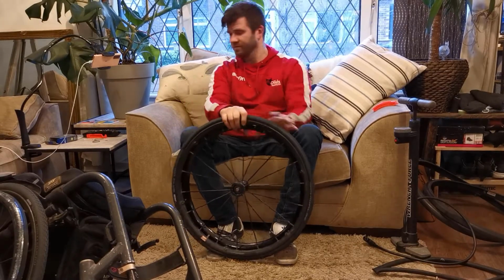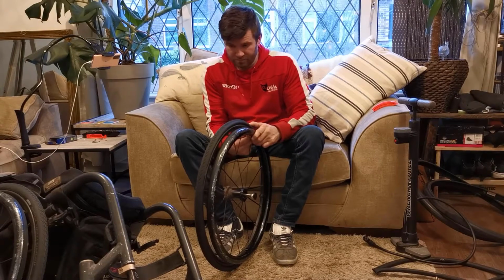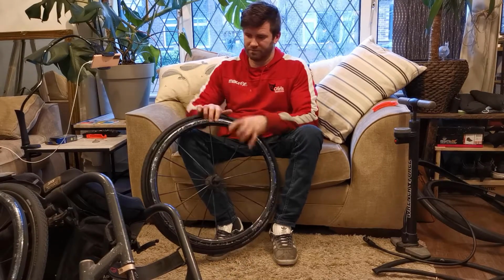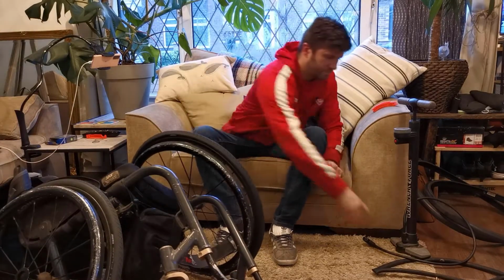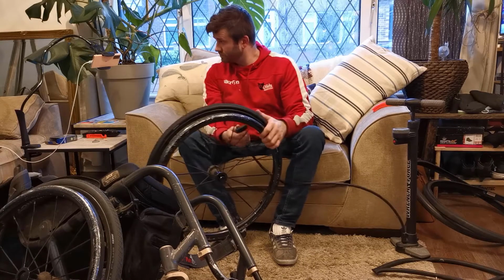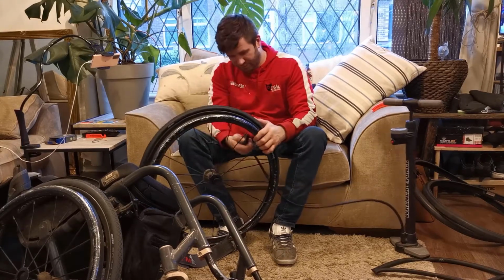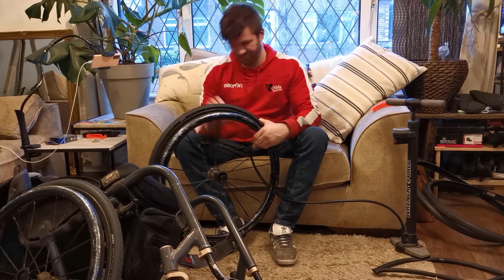Once that bead's on and the tyre's sat on the wheel properly, I can slip the collar back onto the valve, and that collar is really important. Having that collar on is going to stop the valve going inside the wheel when I try and put the pump attachment onto it. And see, you've got to push it quite hard, and that collar just holds it in place.